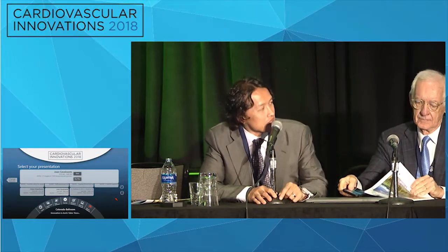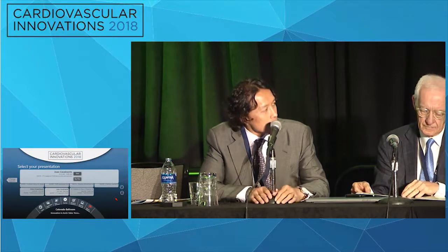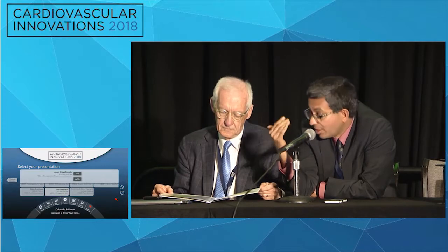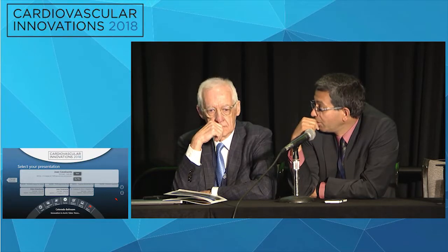I do have one question for Samir. So, Samir, you're heavily involved in the Sentinel study. Do you use it in everybody? Is there anybody who's not a candidate, and how do you choose? So we use it in everybody. Tortuous, non-tortuous, calcified, except for the size. If the size is super large, still these days I use it, even partial protection is better than none. In the last 6 months, we used it in everybody. And if the radial artery is not there, I don't like to stick the brachial, but I would recanalize the radial if possible, so I just stick it and go in. So everybody.